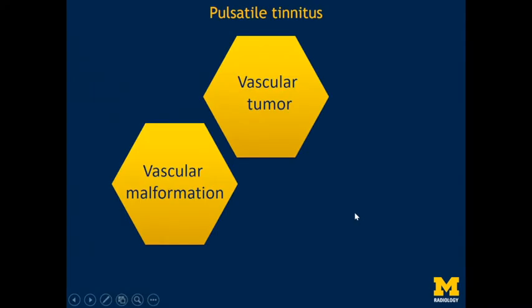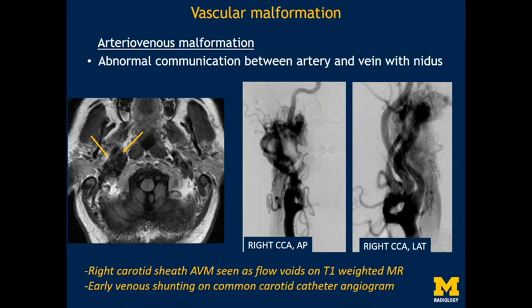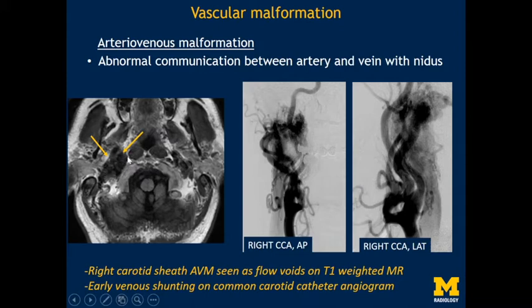The next major category is vascular malformation. These come in various forms: an arteriovenous malformation where the artery and vein communicate abnormally with the presence of a nidus, or an arteriovenous fistula where they communicate without a nidus. Here is an example of a patient with an AV malformation in the right carotid sheath. The right side is expanded with multiple flow voids. This patient underwent conventional catheter angiography, which demonstrated contrast shunting early into the right jugular vein — a complex AV malformation causing significant pulsatile tinnitus.